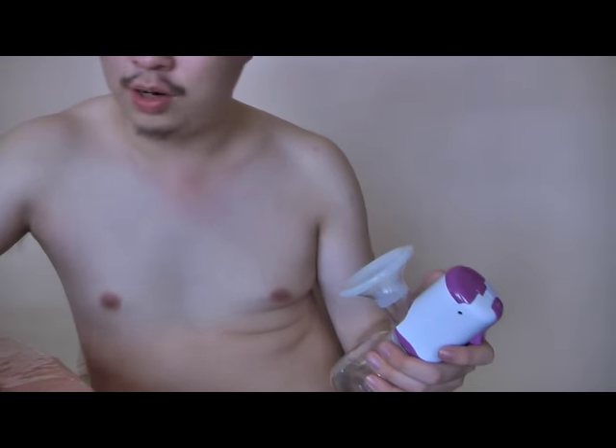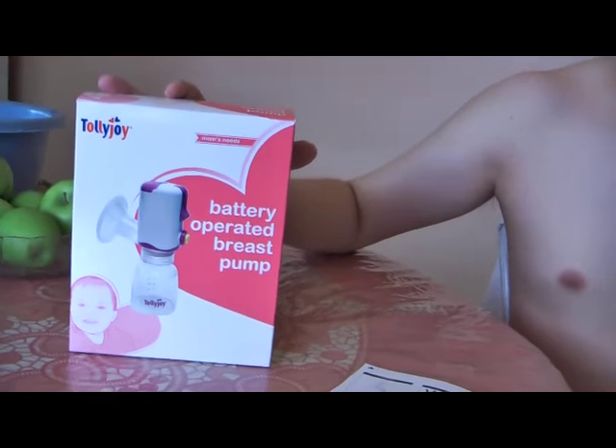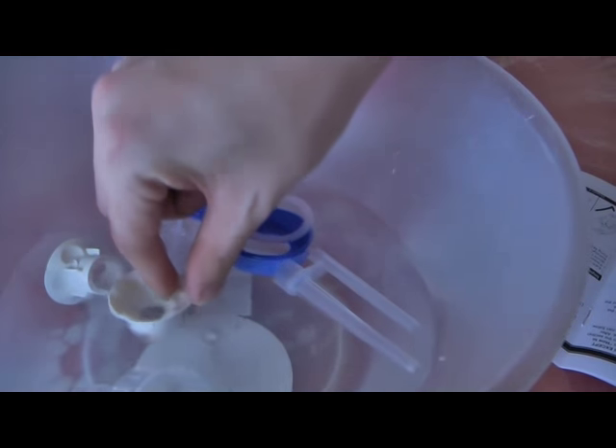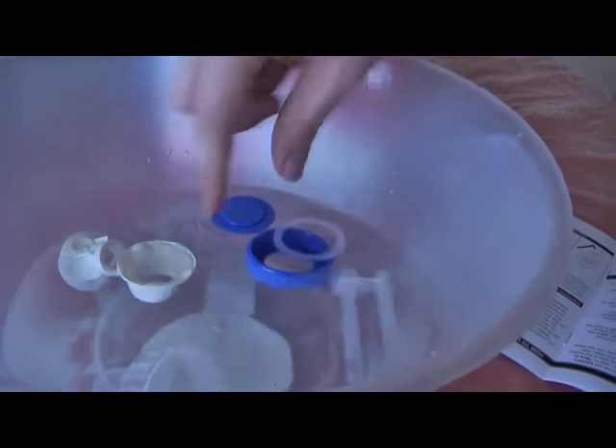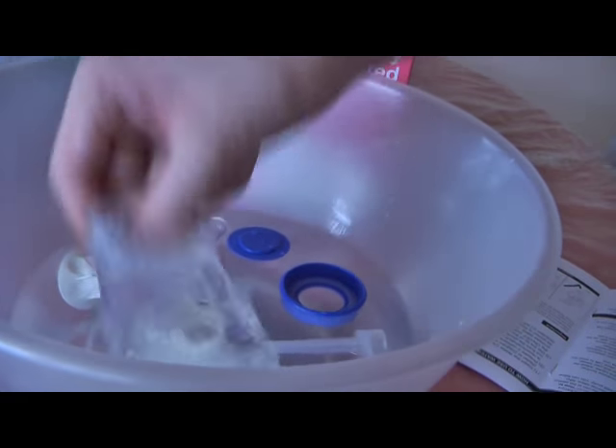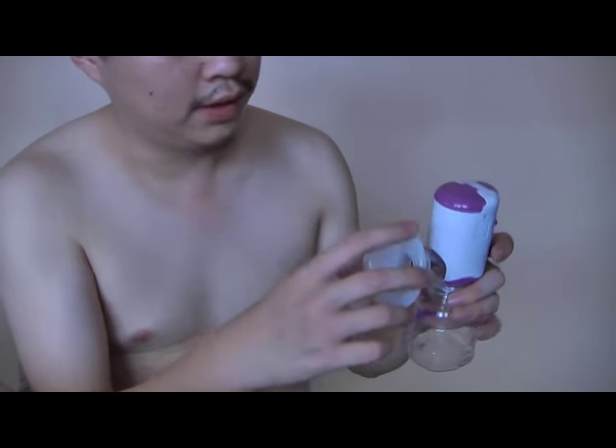I'm going to try it on myself because it's pretty inappropriate for a woman or even my wife to try this on and publish it on the website. The product comes with a manual and we are sterilizing some of the other components using hot water. This is what we call the nipple stimulator. This is the valve. All these are the bottle container. This is the bottle nipple and the bottle cover. It also comes with a bottle, the funnel unit, and the motor.